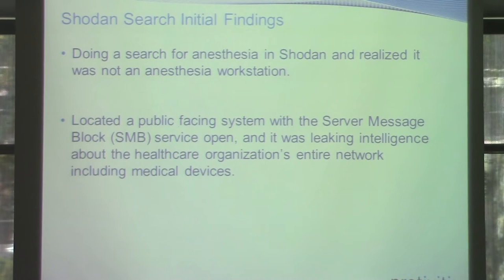So when I say medical device, I don't just necessarily mean the medical device itself, but it could be one of those other systems or servers that has a vulnerability that can directly interact and push instruction sets through an application, through a web service, things like that. So there's a lot of that going on that affects the medical device operation that isn't necessarily a vulnerability directly inside the medical device.